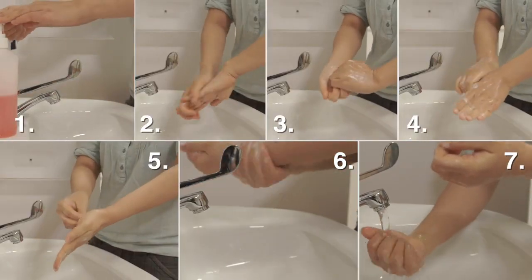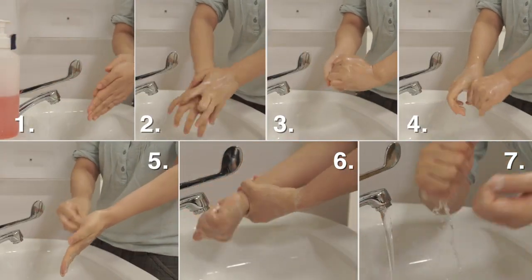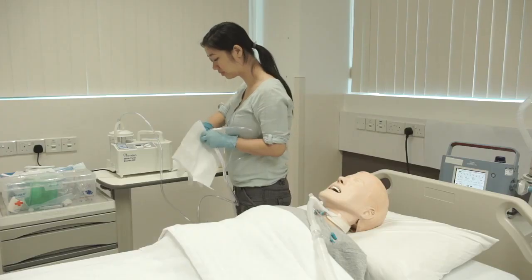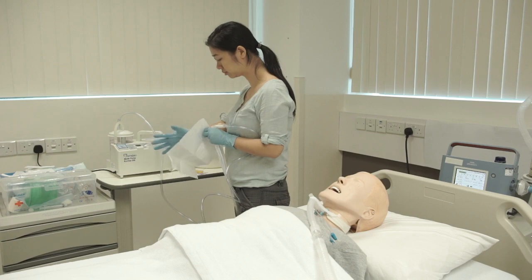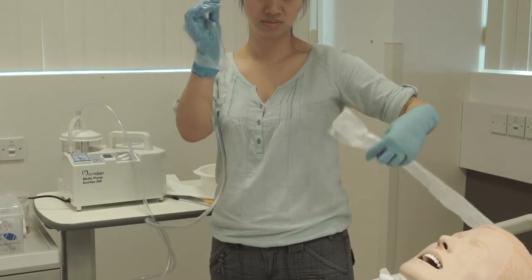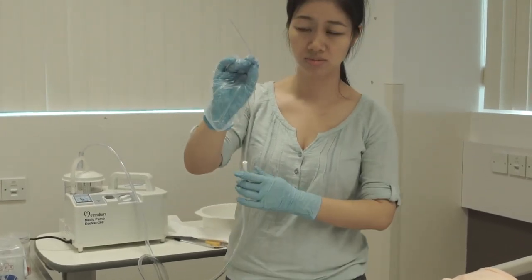Always wash your hands before touching the tracheostomy tube. Connect the catheter to the suction tube. Wear sterile gloves on your dominant hand. Hold the sterile catheter in the hand with the sterile gloves. Avoid contact with the non-sterile area.